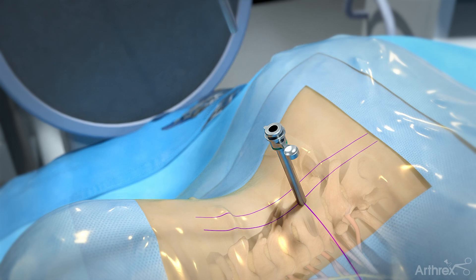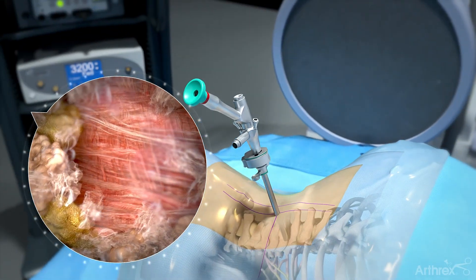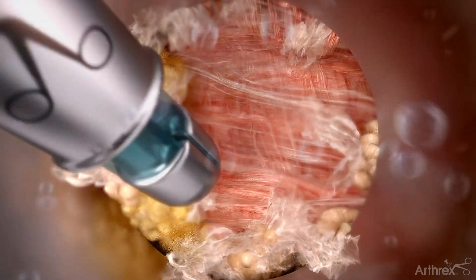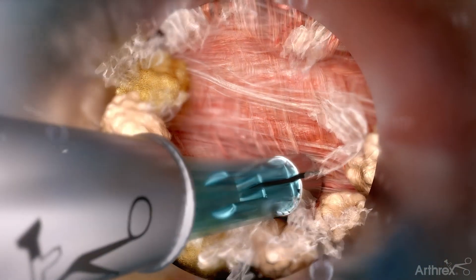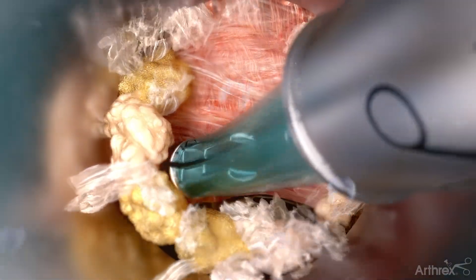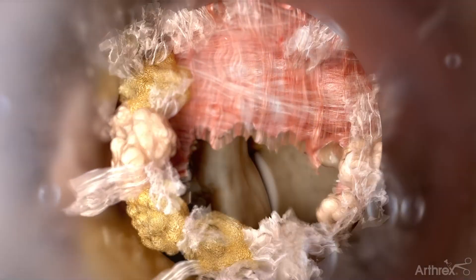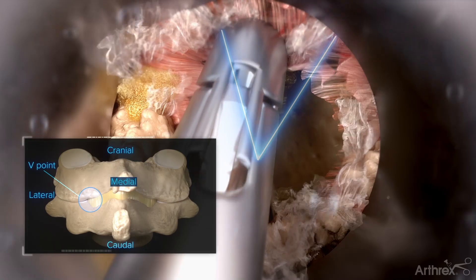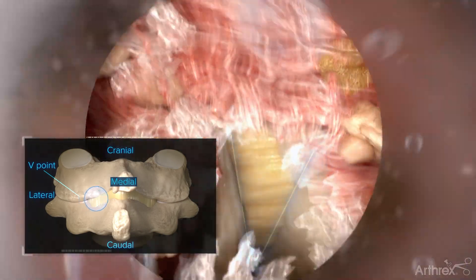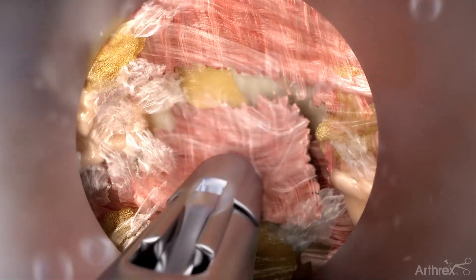Remove the dilators and introduce the endoscope. Expose the facet joint using the flex tip probe and cup graspers to remove soft tissue, and begin to work medially to expose the v-point comprised of the upper and lower lamina. Continue to expose medially towards the spinous process, beginning your laminotomy on the cranial and ipsilateral side.